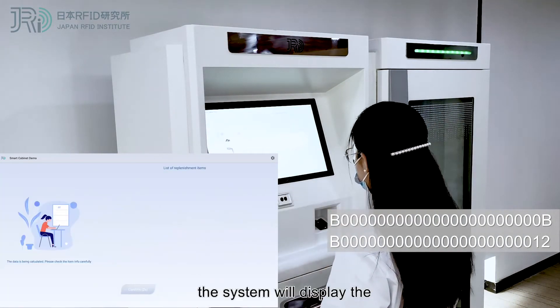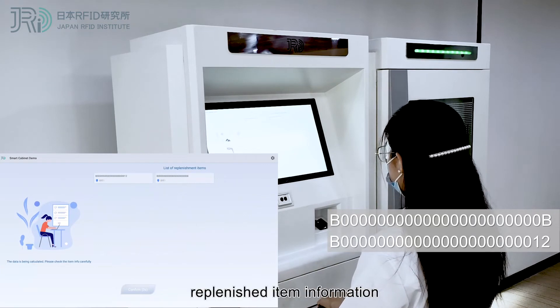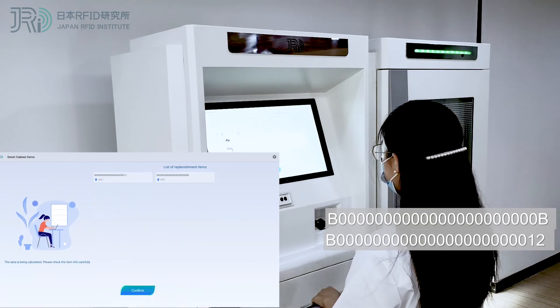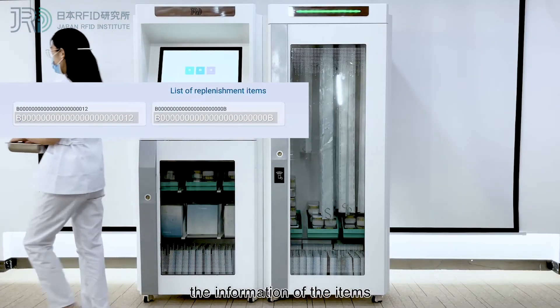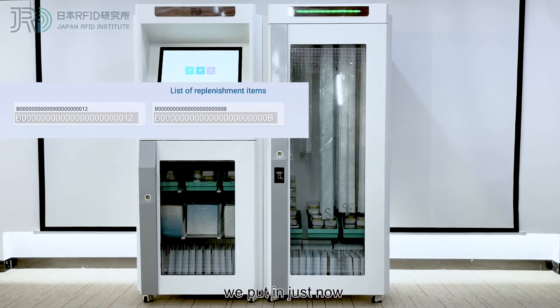Click Next. The system will display the replenished item information. We can see this is exactly the information of the item we put in just now.